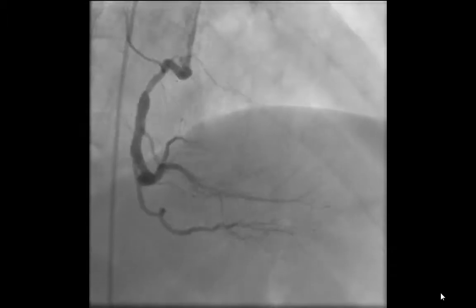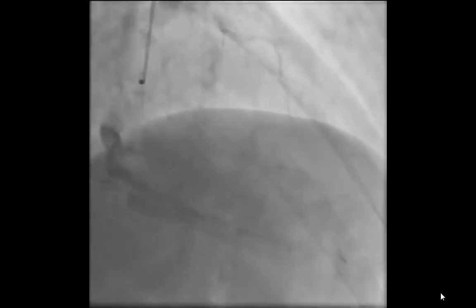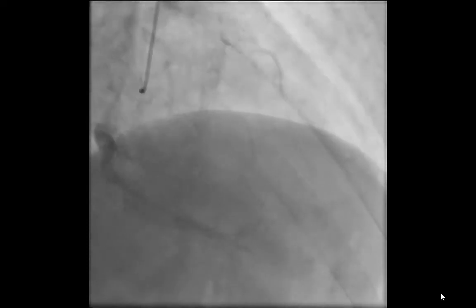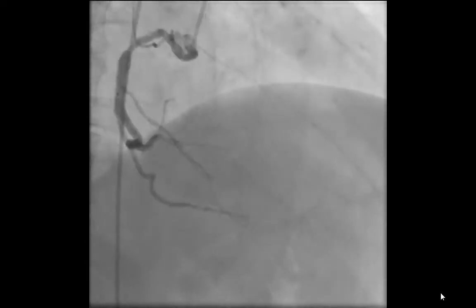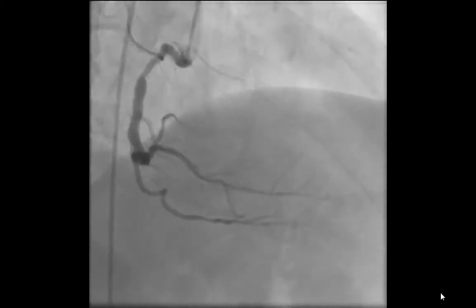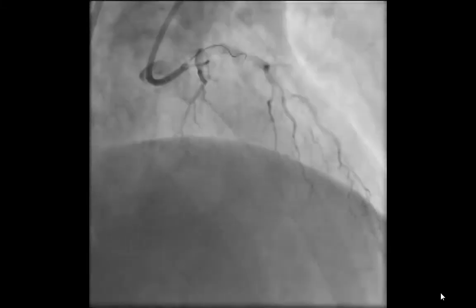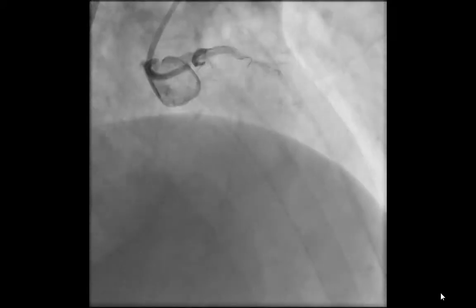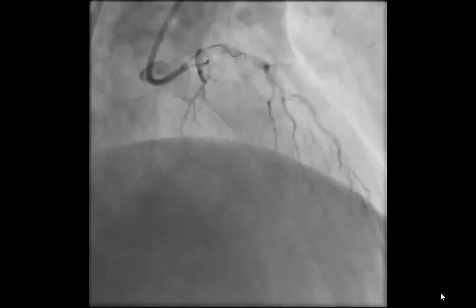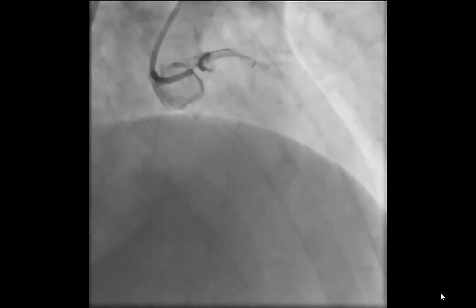Retrograde injection from the RCA showed collateral filling of the distal LAD, which appears to be a large vessel supplying a large amount of myocardium all the way down to the apex without significant disease distally, which was the encouraging factor here. Attempts to wire the LAD initially were unsuccessful, again because of poor purchase on the LAD and prolapse of the wire in the large side branch.